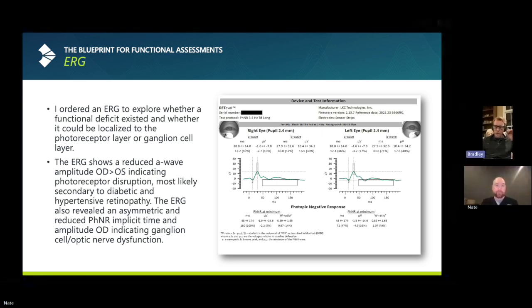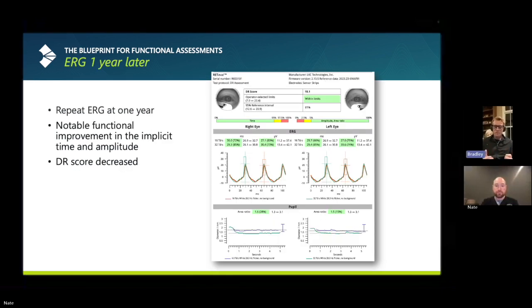Yeah, I would agree. And one thing I would say to this audience is, don't let the idea of needing to know everything about retinophysiology and electrophysiology inhibit you from incorporating this type of technology, right? If you can understand enough to say thick retina, stressed retina means slower and weaker response, you already know 200% more than your patients do, right?